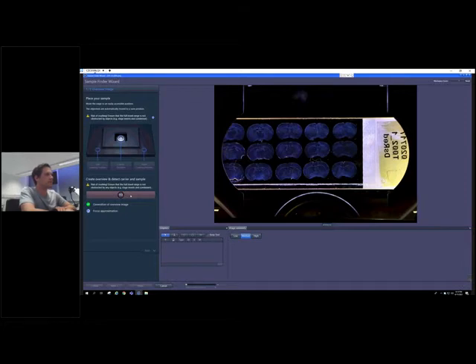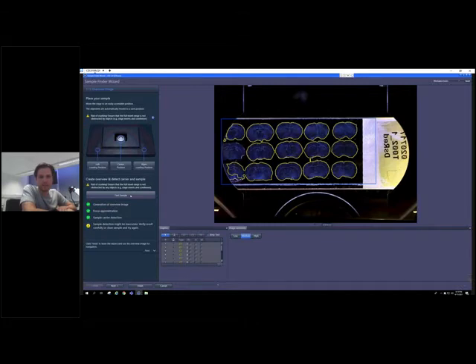First of all, they will identify the carrier type. So in this case, it will automatically recognize that it's a slide. It will automatically look for a cover slip, which has been correctly identified. Then another segmentation will run to identify the tissue sections, which are highlighted here in yellow. And there will be a final net, which runs a quality check and gives you an indication on whether your sample is clean or might benefit from some further cleaning.